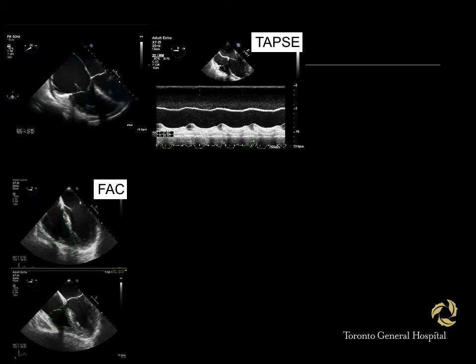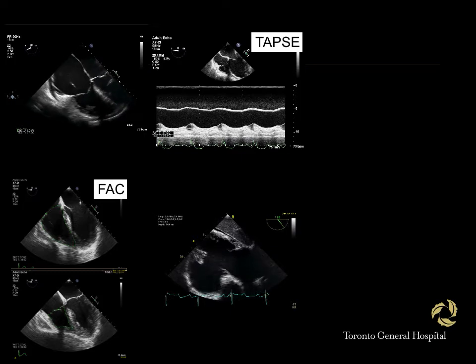One way is to try to get a picture similar to the transthoracic one. And one way to get a similar picture is to go into the stomach, retroflect, and look at the ventricle from the bottom.